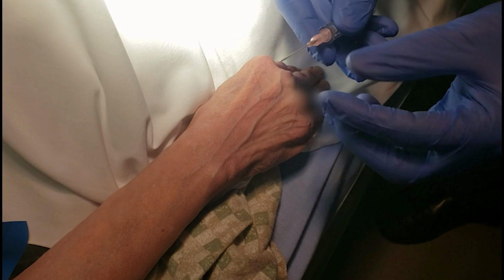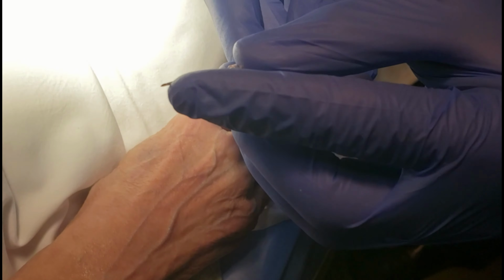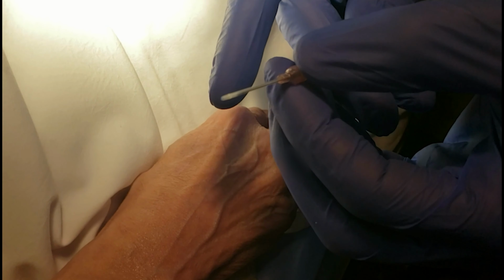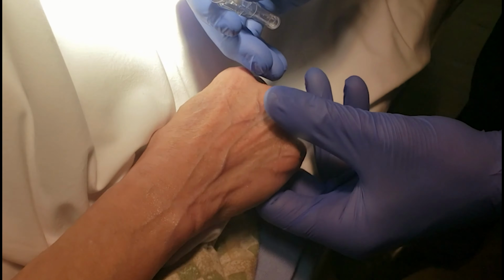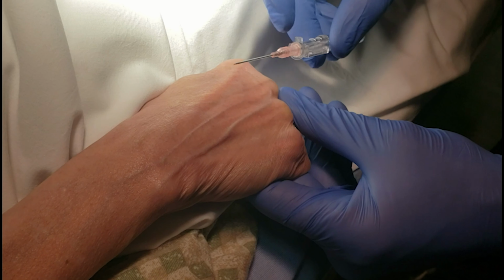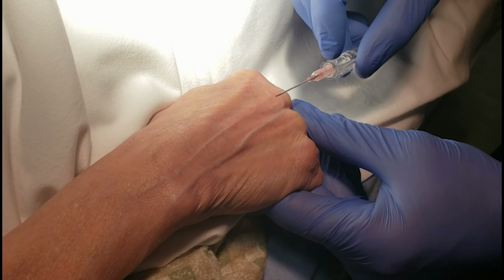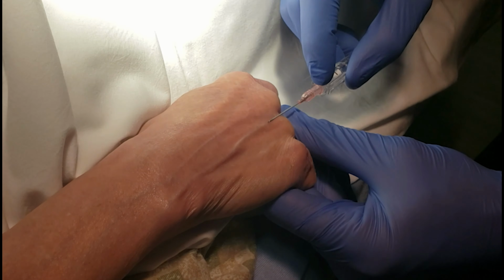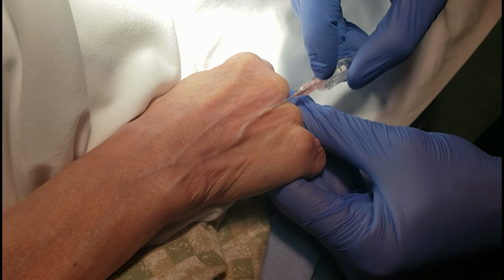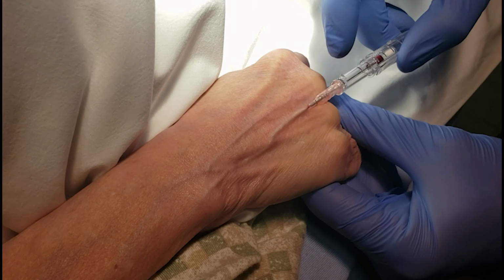The other thing is I'm using a 20 gauge IV. This has about a 3 millimeter bevel. So I want to make sure that the whole 3 millimeters of the bevel is in before I advance. So pull down, thumb out of the way. Now I'm able to have a smooth entry. With that smooth entry, you're going to feel a small pinch. I come in, and you can see how the vein just moves a little bit. Now I'm in, I advance 3 millimeters, I thread the catheter, and we're done.